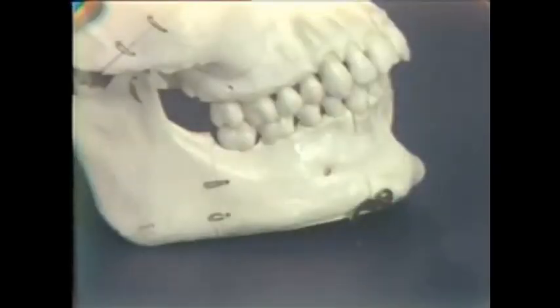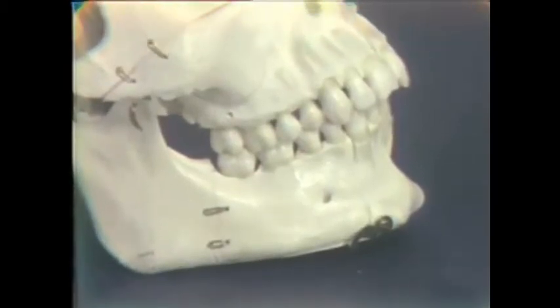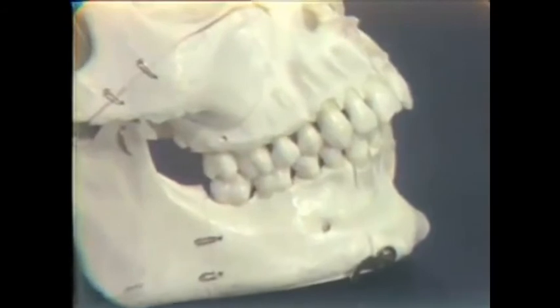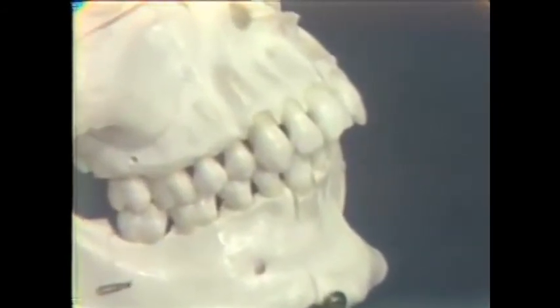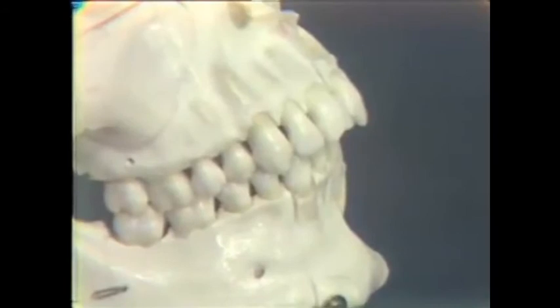Let us now depict anesthetizing the maxillary cuspid, and in so doing, we'll recall that the nerve supply to the cuspid and the incisor teeth is the anterior superior alveolar nerves. Remembering again that the cuspid root is a little longer than are the bicuspids or the incisors.